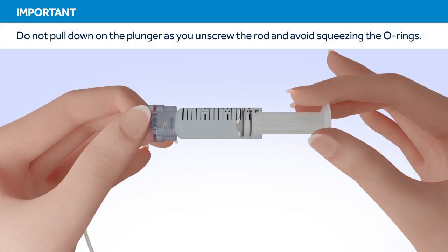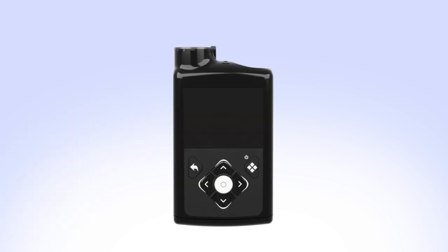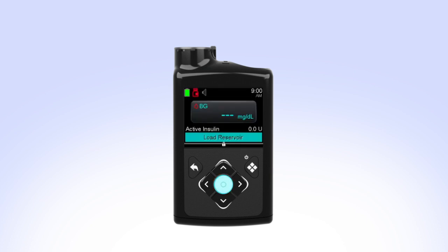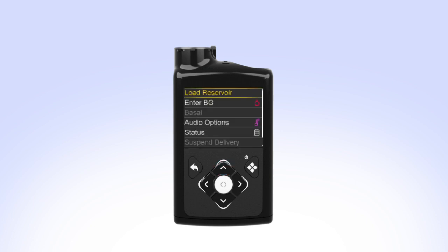Unscrew the plunger rod counterclockwise until it completely separates from the reservoir. While you are filling your reservoir, the backlight may have turned off. Press the select button to turn the screen on again. If your pump is locked, press Select on the home screen. You will see the unlock screen. Press the arrow that is highlighted to unlock the pump and continue to the next screen.